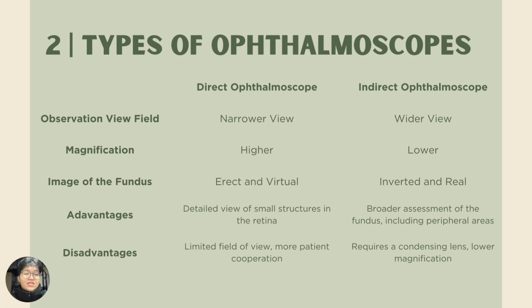While it offers advantages such as detailed views and higher magnification, the direct ophthalmoscope has limitations. Its narrow field of view can make it challenging to examine the entire fundus, and it requires more patient cooperation to maintain a still eye during the examination.